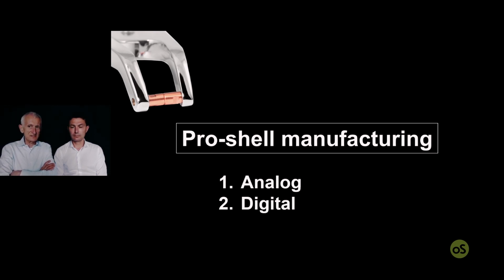So we decided to divide this into lessons. For this reason, we have now an hour where we discuss this analog approach. And the next lesson, we will discuss all the digital aspects of a construction of a digital shell, whether it's CAD/CAM or print. We will see that.